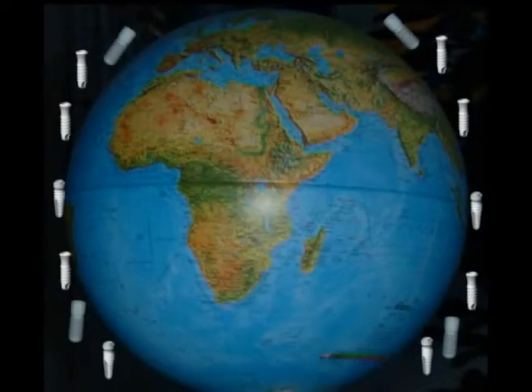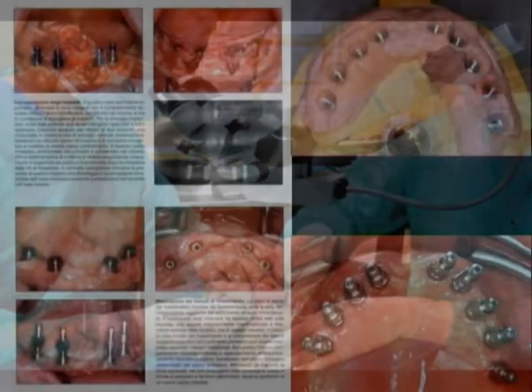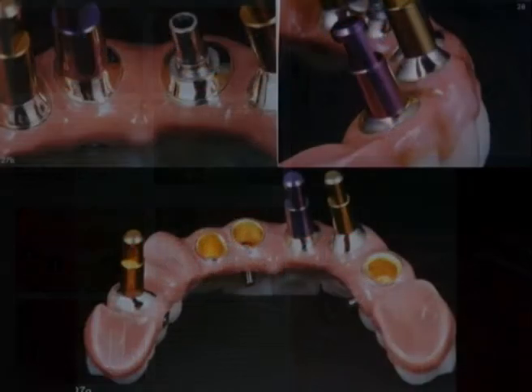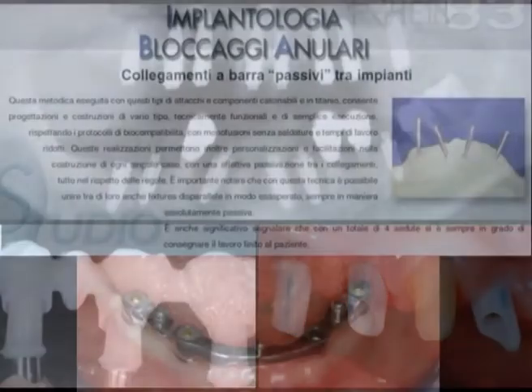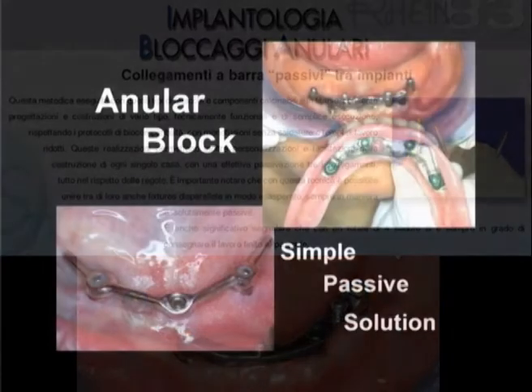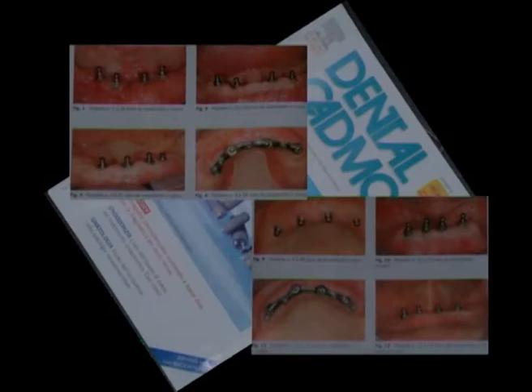Implantology is continually becoming a more commonly used procedure worldwide. Implant-retained overdentures have nowadays reached an excellent technological level, but are only affordable to the most qualified and best equipped labs. In order to make this procedure available to any socioeconomic level, we need alternative techniques and procedures which, while respecting international standards of quality, can be practiced and adopted by every lab by simply using the standard equipment available, and be able to reduce time and cost in order to deliver affordable prosthetics to any social level or status.